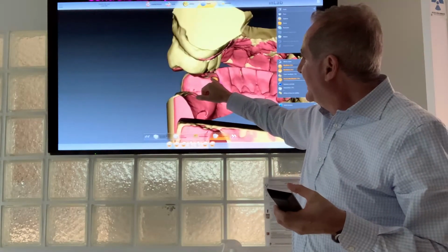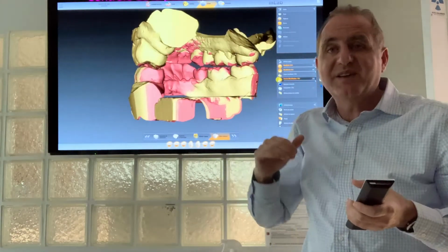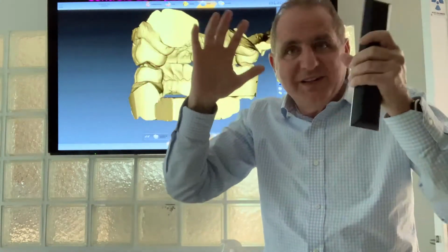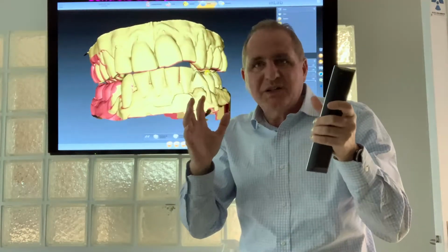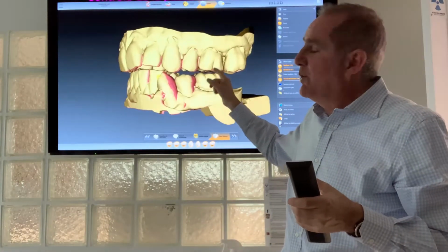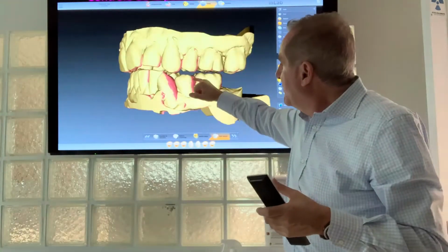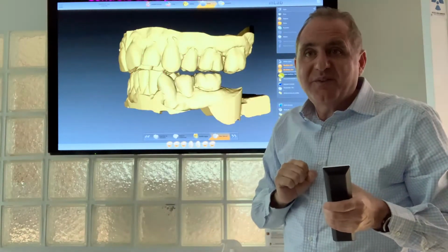So you see here, we can see yellow and at the same time red on the occlusal surface. It means that we are in a nice posture, a nice position that is okay. We're not so weird. So everything is okay here. And I will show you after the wax-up that we completed over this model, to see the final outcome.